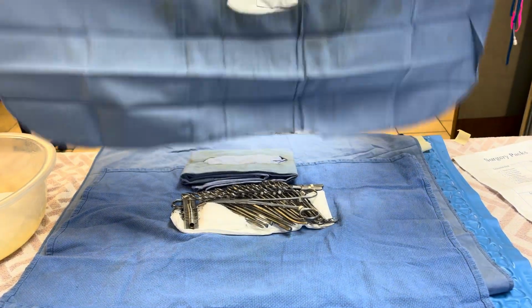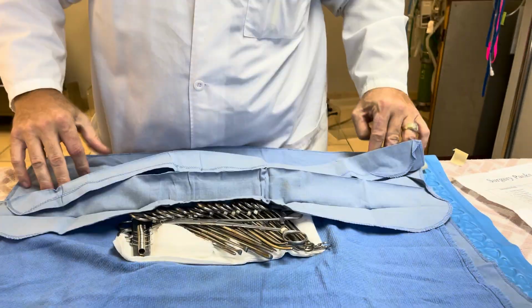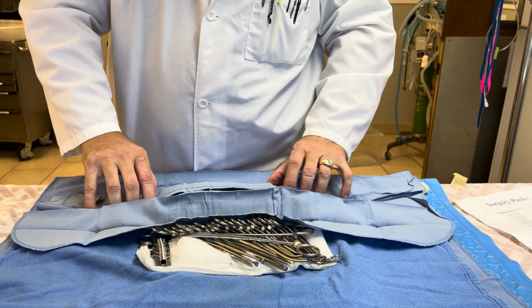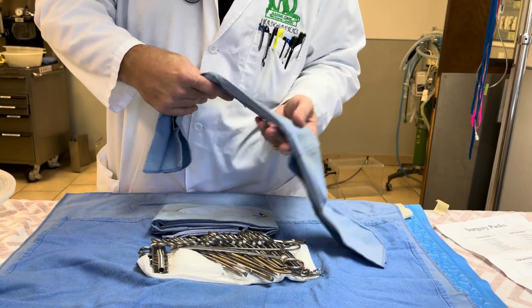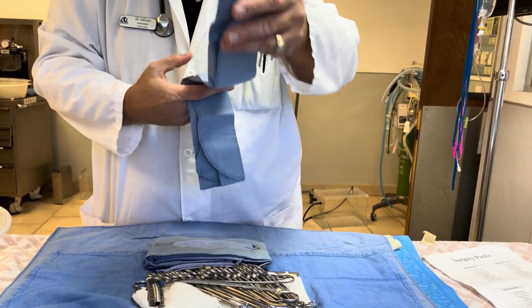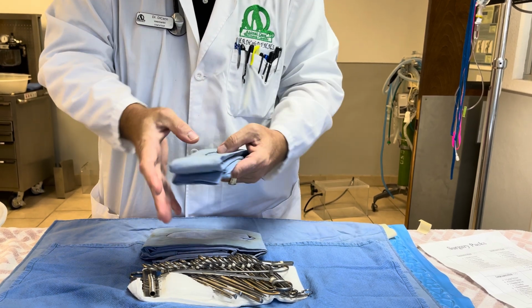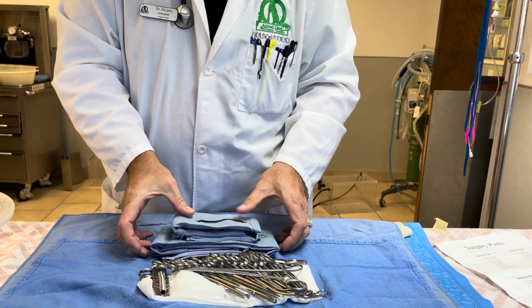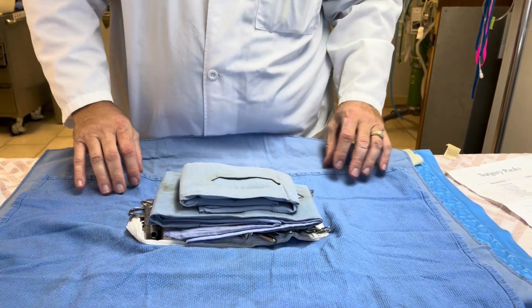Okay, so this is a small drape. You want our fenestration to be in the middle. Most of these drapes that we use, you can see, they're creased like an accordion. It makes it very easy for you to fold them, okay? So you got two of those. That's the last thing. Once you have your pack, you put those right on top, okay?